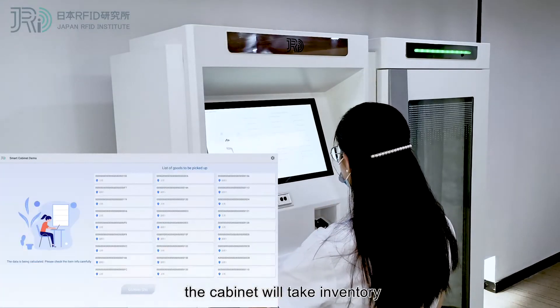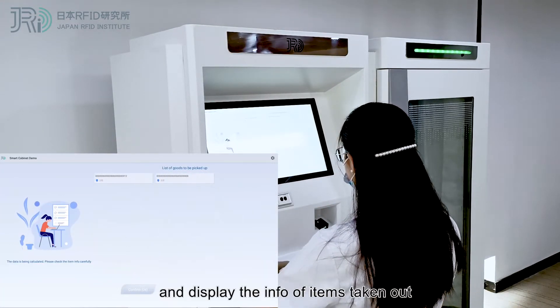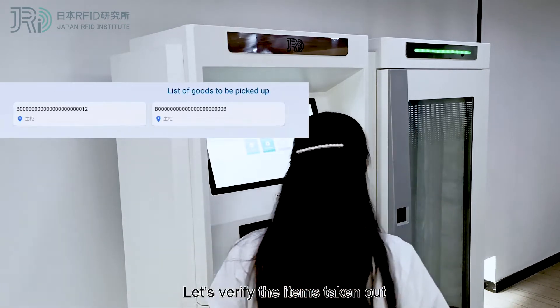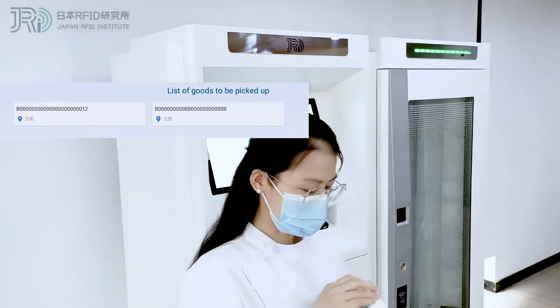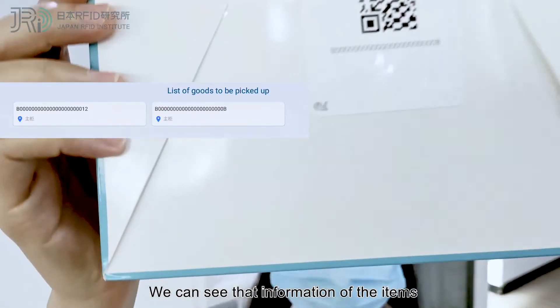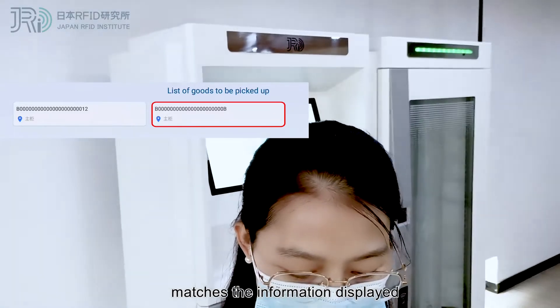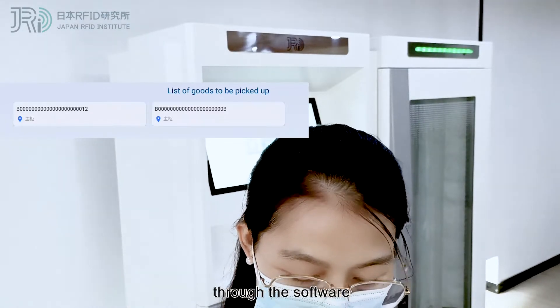The cabinet will take inventory and display the information of items taken out. We can verify the items taken out — the information of the items just taken out matches the information displayed through the software.